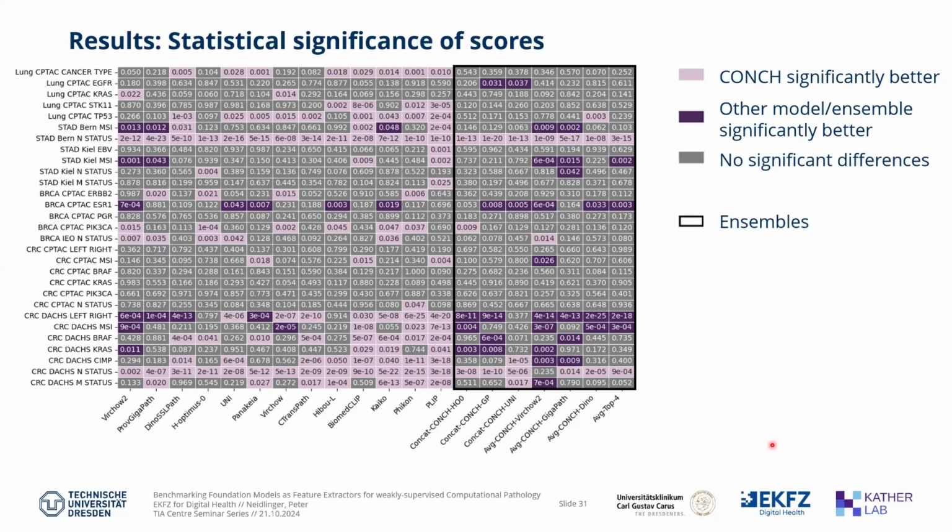Yes, that's something I looked into. Definitely, if you look at the subgroups, if you look at BRAF predictions only in the MSS subgroup or only in the MSI subgroup, then the AUROC is quite a bit lower, but I didn't do it systematically.